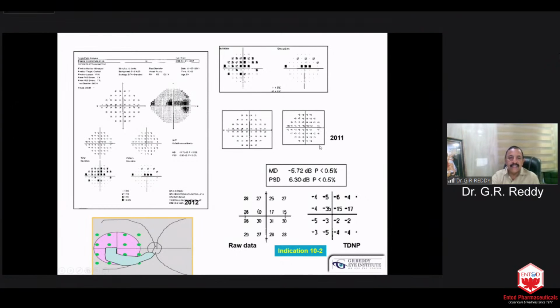In 2011, I saw this patient. Only the 24-2 SITA standard, a well done field. False positives are 1%, false negatives are 7%, and fixation losses 1/18. You see there are 3 scotomas. Always see what it is, it is absolute scotoma. This point is absolute scotoma. Otherwise, the other points of the 16 points have good retinal sensitivity, only this is -35.